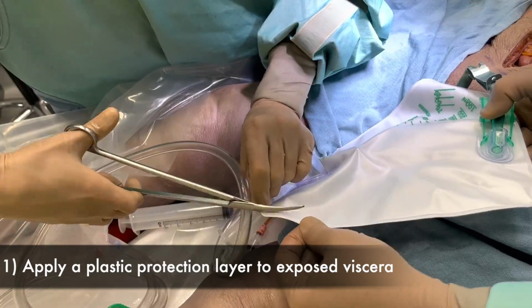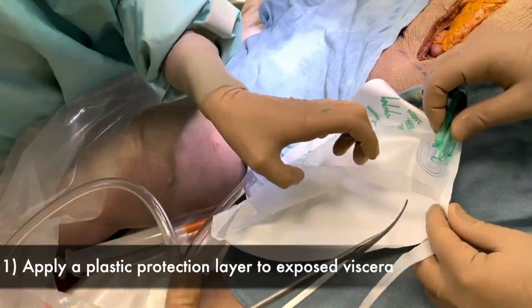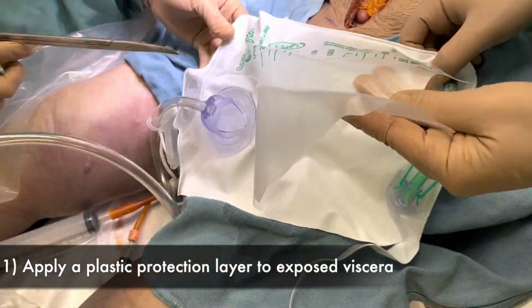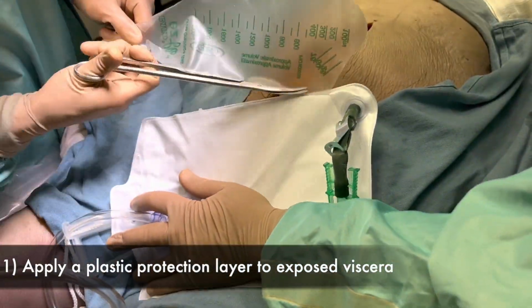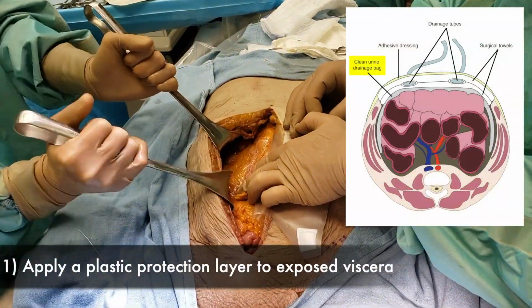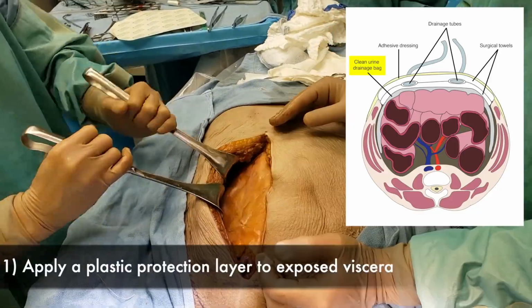To begin, a plastic bowel protection layer will be created to protect the viscera. In this video, plastic from a clean urine drainage bag was repurposed to cover the exposed viscera. Apply the plastic sheet to the open abdomen. Tuck the edges of the plastic under each side of the peritoneum.